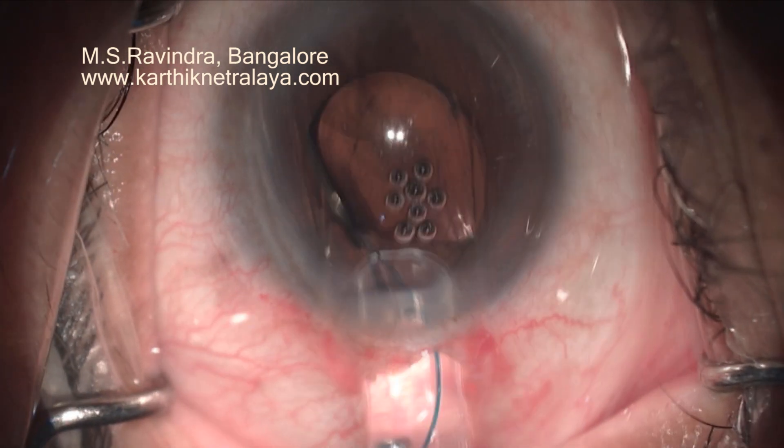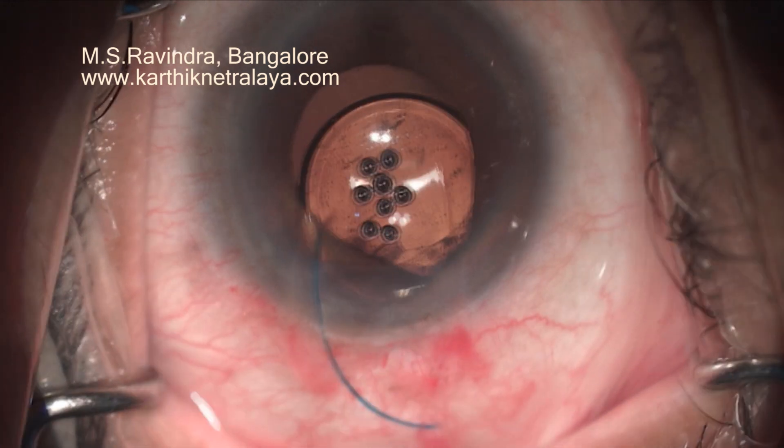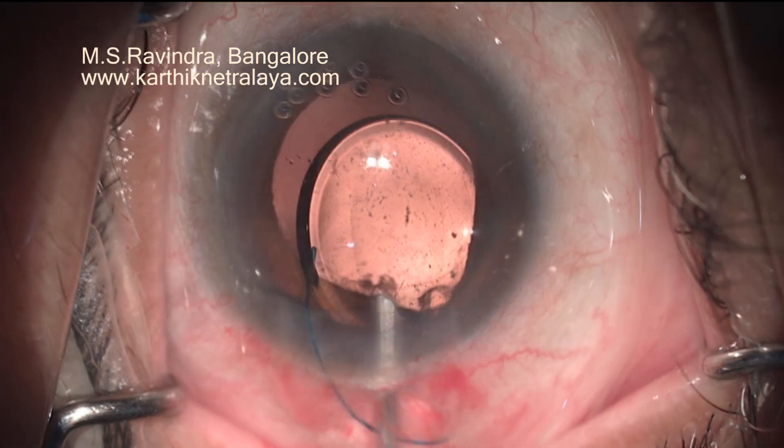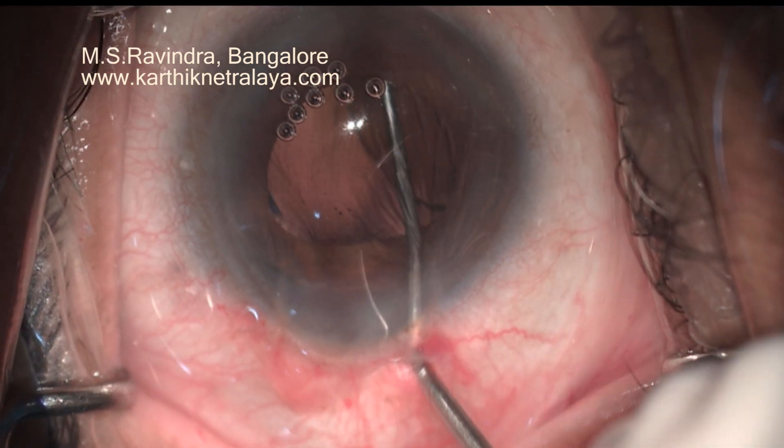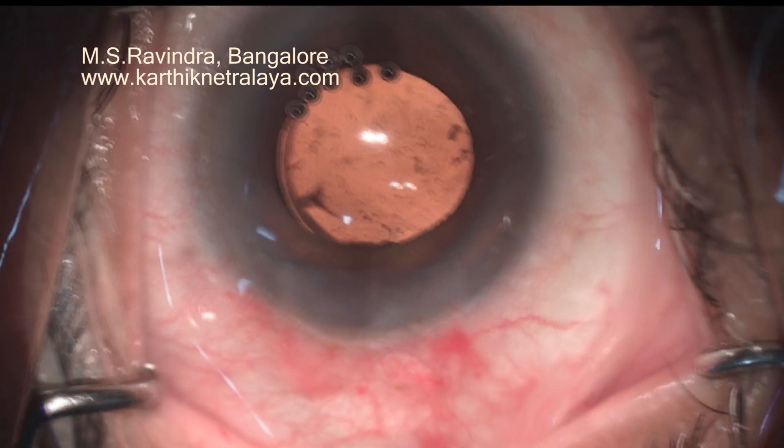It doesn't have to somersault inside the eye. Now rotate it so that even the trailing haptic is straightened, so that it does not make the lens go upside down. Entire visco is aspirated.